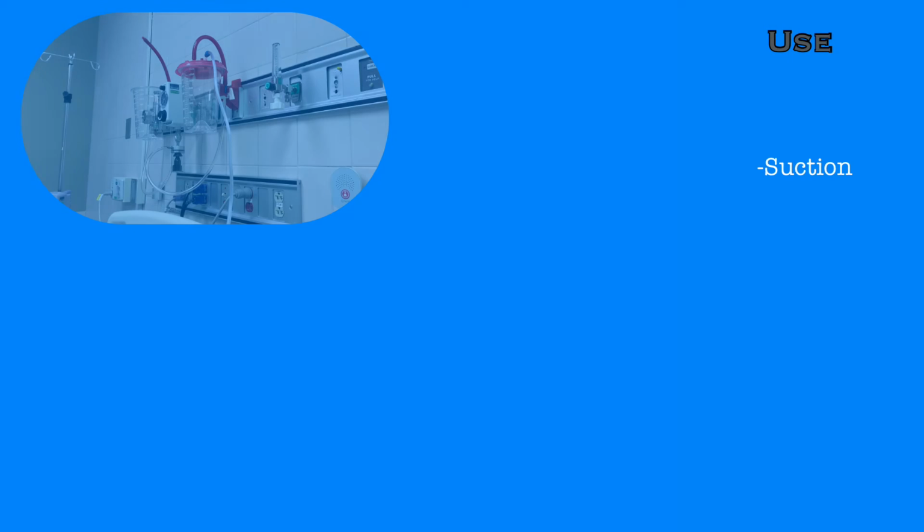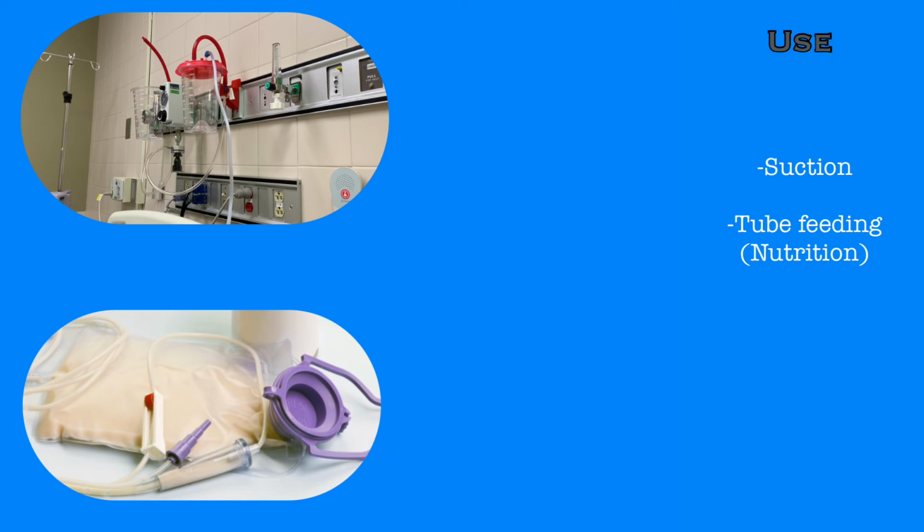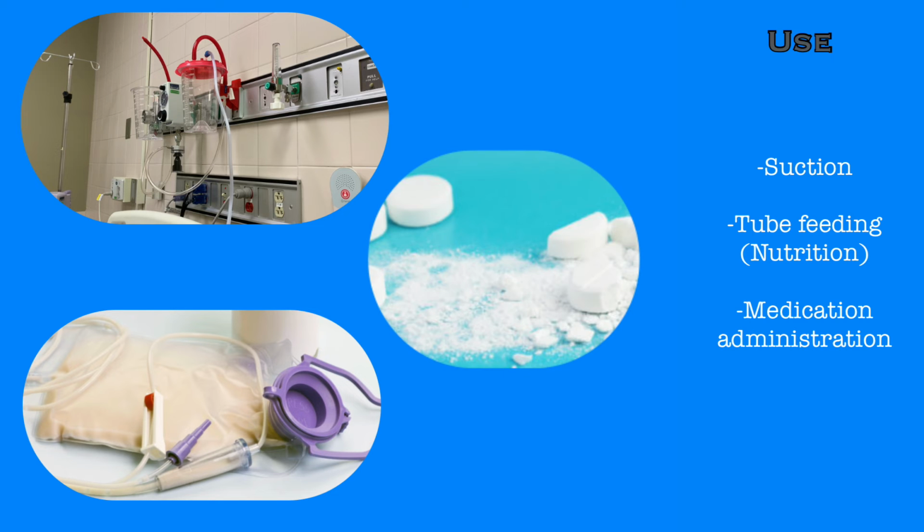With the tube secured and placement verified, you can now safely use the NG tube for treatment. That may mean setting it up to suction. It may mean setting up a tube feeding. And on the inpatient setting, it will commonly mean using it to administer medications.